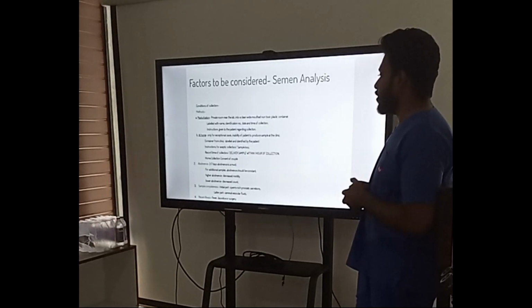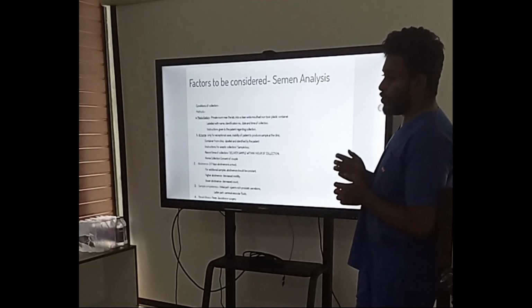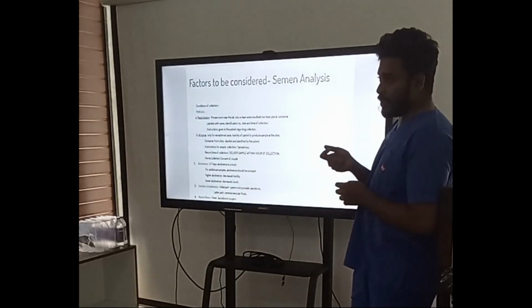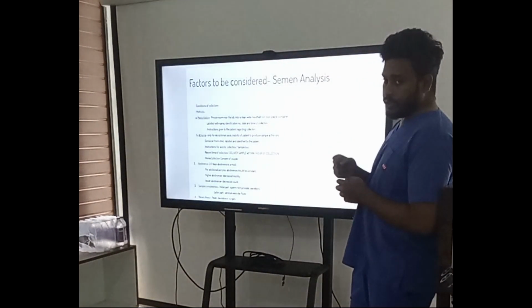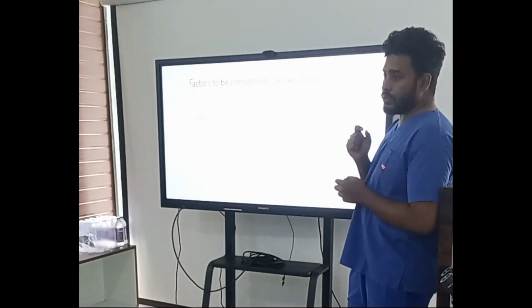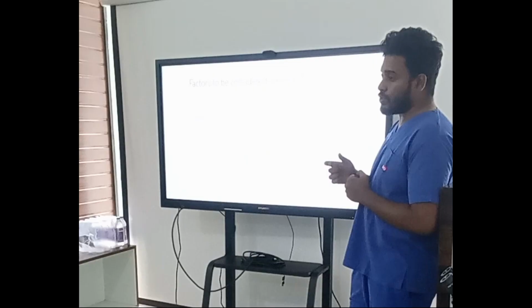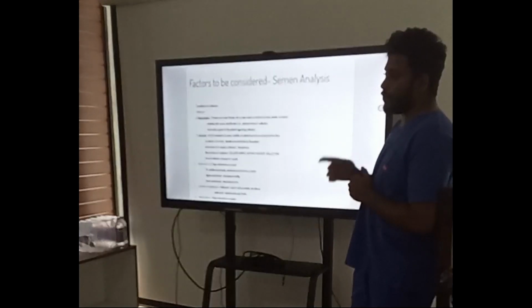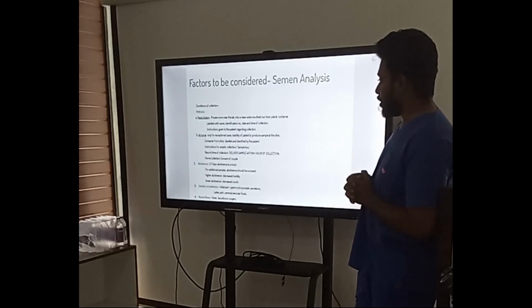by the patient himself. The instruction given to the patient regarding collection is that they should not spill the sample before or while they are ejaculating. They have to collect from the starting drop till the last drop, because the initial drop consists of rich, concentrated sperm. The initial spillage will cause a reduced volume, so you will give a biased treatment to the patient if you have not known that. So we have to give them proper instructions about the collection.